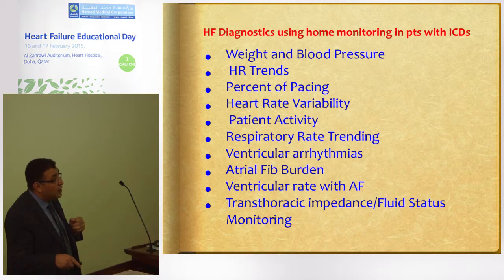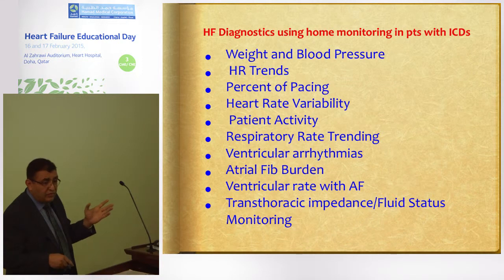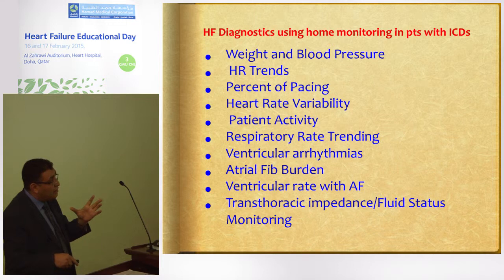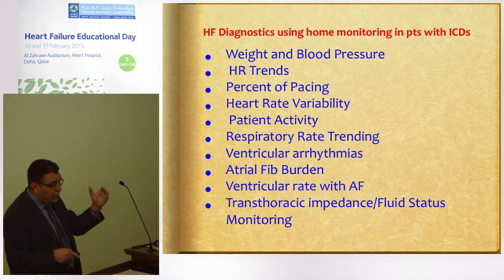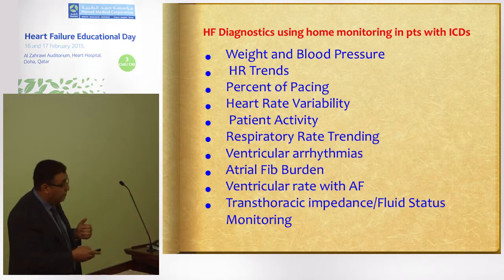The transthoracic impedance, and this we have in at least 50 patients, and they have an alarm. If this impedance goes up, at a certain time in the morning it will beep, and the patient will come to the clinic in a day or two. We interrogate the device and we examine him clinically. This is usually an early stage of heart failure. We could increase the dose of Lasix and avoid hospitalization.